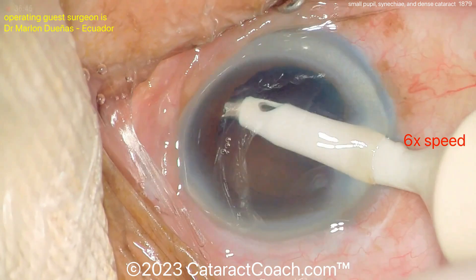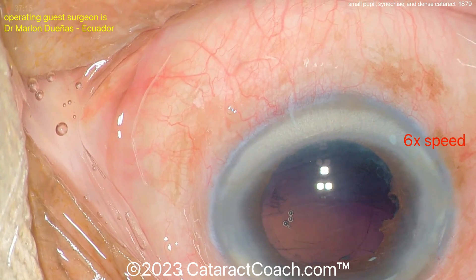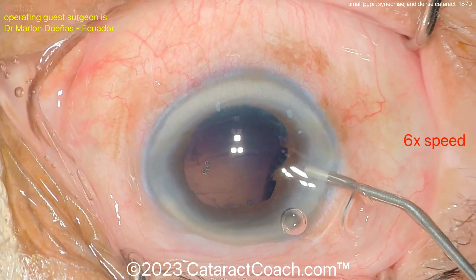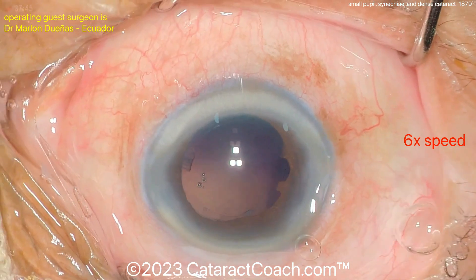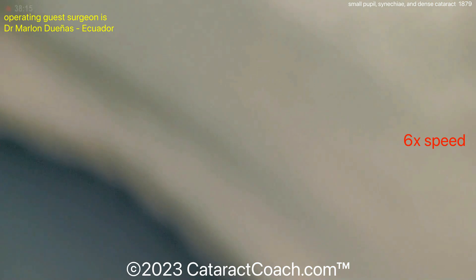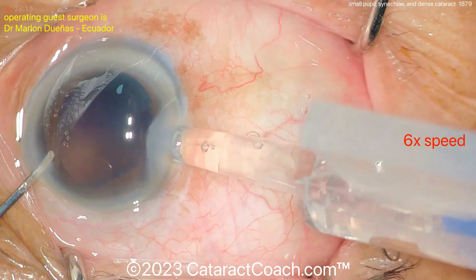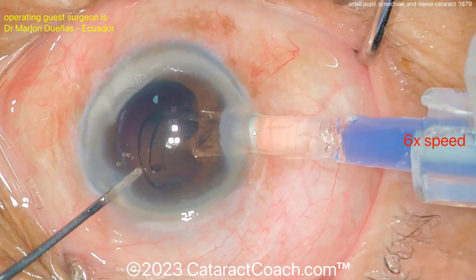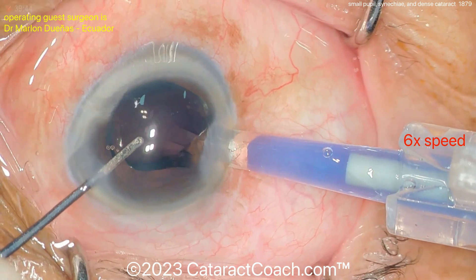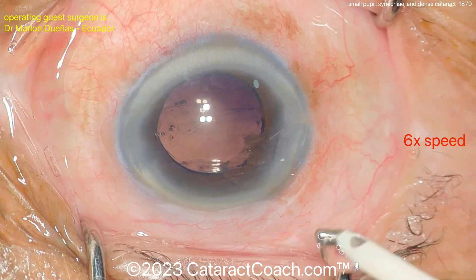This patient will certainly have more post-op inflammation. Ask yourself why the patient had synechiae in the first place — typically it's a patient with uveitis or previous iritis causing that inflammation, and they may be more prone to it again. You want to get the eye as quiet as possible before surgery to minimize the post-operative inflammatory response. In a case like this, inject preservative-free triamcinolone into the anterior chamber.